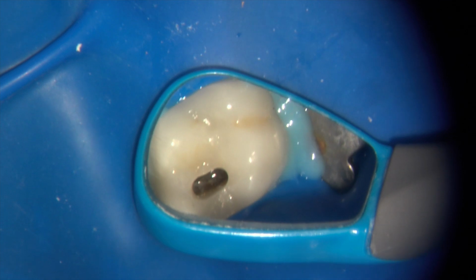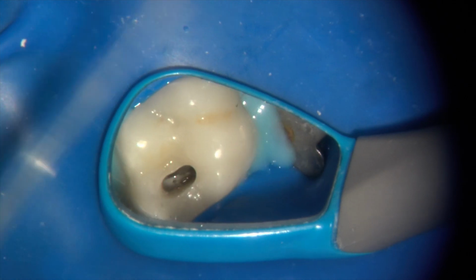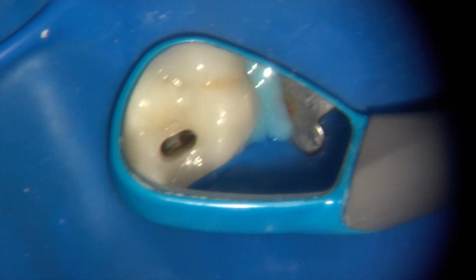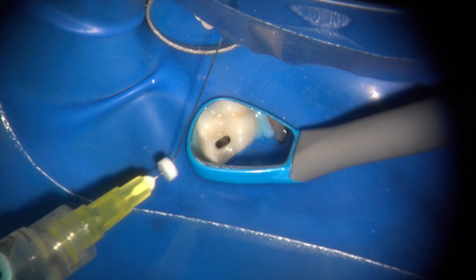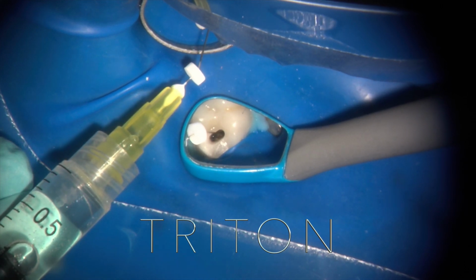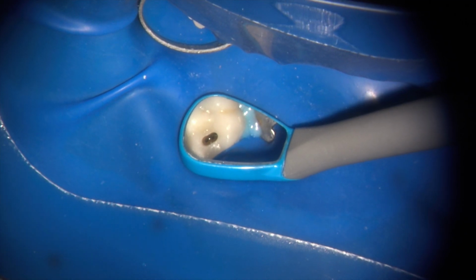We find it. You always need to then isolate the tooth for secondary isolation using here in the sequence flowable dam material. And this is because I need to be able to see the CEJ for proper access, and then after I found the canal, I add this secondary isolation to seal the area, and then I proceed to do my proper irrigation, first removing the gutta percha with the chloroform, and then once the gutta percha has been removed and the MB2 has been found, I'm going to move on to the use of TRITON, which also, as you know, is a sodium hypochlorite-based solution, and that is used here for our disinfection and the removal of this long existing biofilm with the addition of some ultrasonication and agitation.